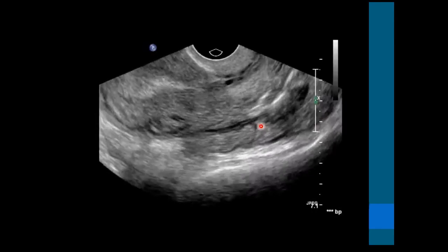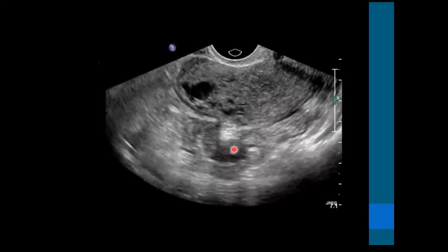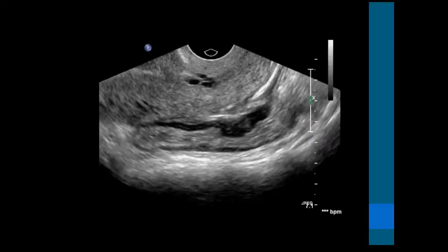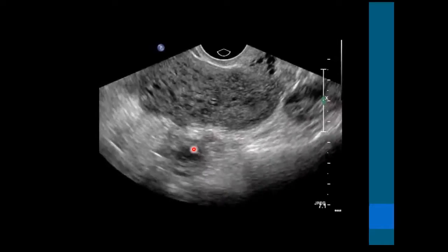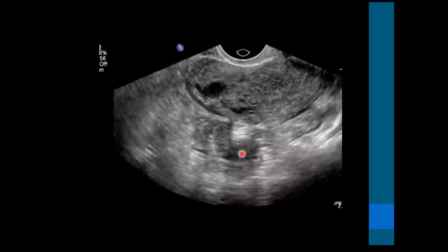So sometimes you just see the bowel lesion. You're doing your scan and you just see the lesion on the bowel just here. Most of the time, however, you have to go and look for it especially. And it's surprising because if you do the scan, you may easily miss this lesion, although it may be obvious now because I point your attention to it.